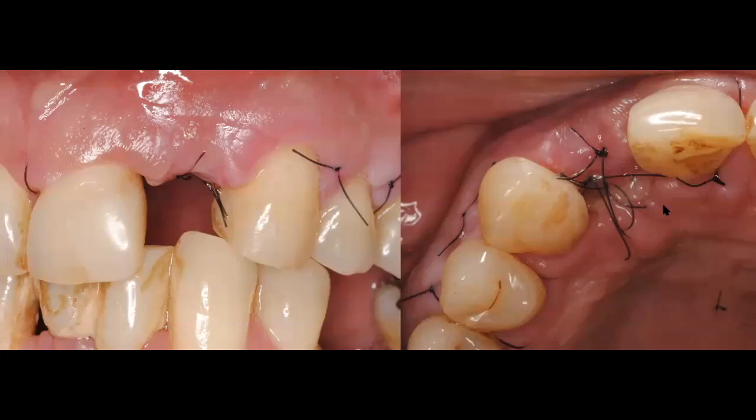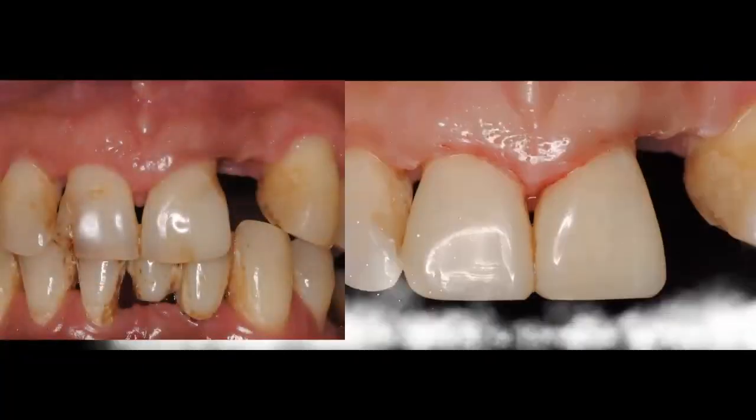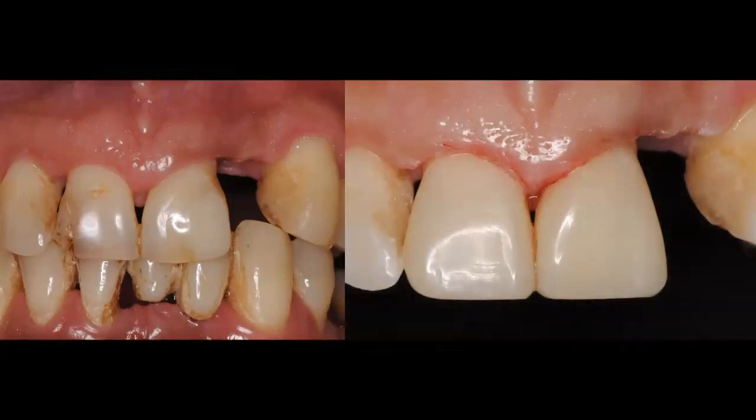Now, nothing wrong with using something like that. That may be something that you would like to use. But personally, again, my goal is to have the least amount of pressure in the site right after my surgical procedure, because I want to try to keep that site without any disturbance. So this is now maybe I would say 4 months later.